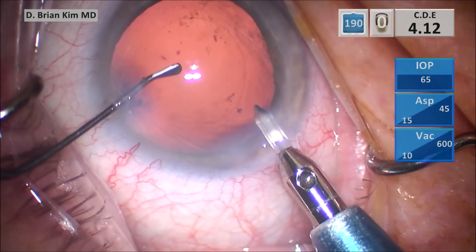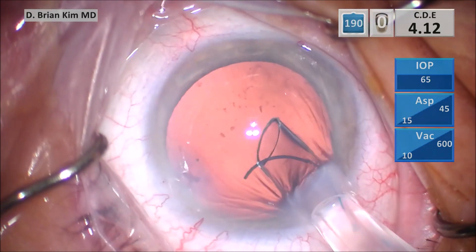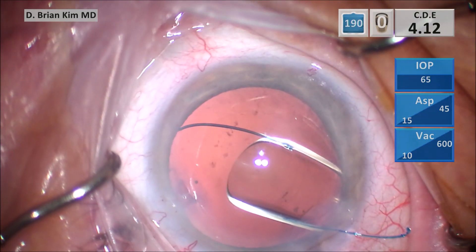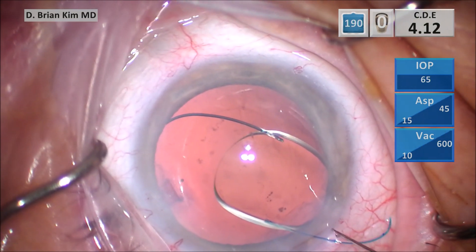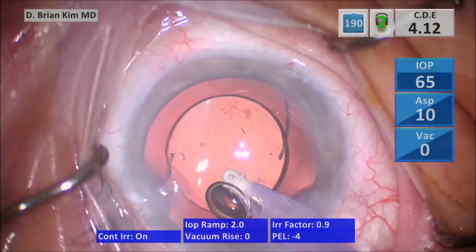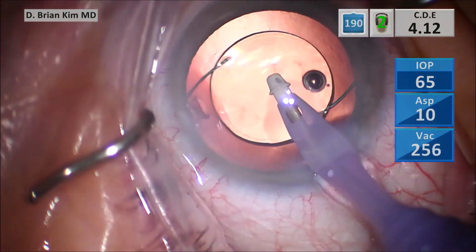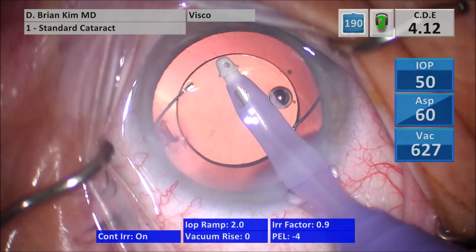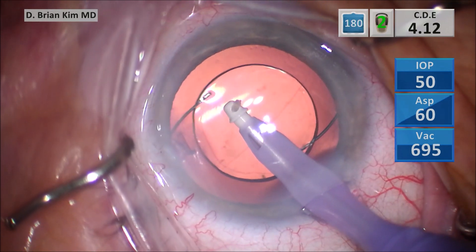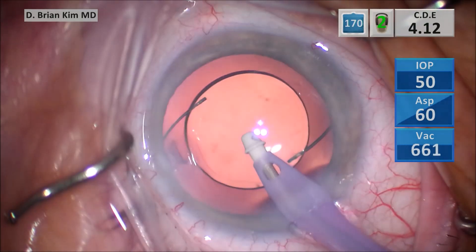I'm going to widen the incision because this is a three-piece intraocular lens and my incision is about 2.6mm. I'm going in with the injector bevel down. As the leading haptic is advanced the bevel should be pointed towards the left and the haptic comes out planar. The optic should come out flat in the proper orientation and the trailing haptic swept to the right, then I'm using a Maltzman to help deliver the trailing haptic and it dials in nicely. I use the I&A handpiece to go underneath the lens first, remove any viscoelastic from between the posterior capsule and the underside of the lens, and then evacuate viscoelastic from the anterior chamber — especially in the angles. Because of the density of the lens it does cause some fragments to come out, so you have to be very careful doing a good cortical and viscoelastic cleanup.